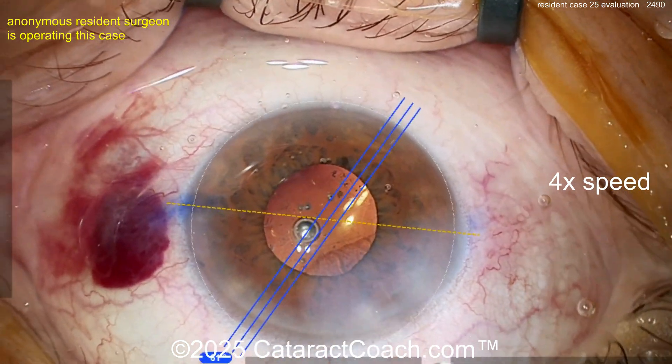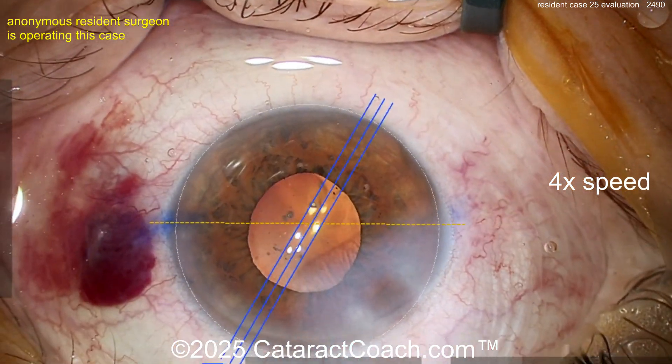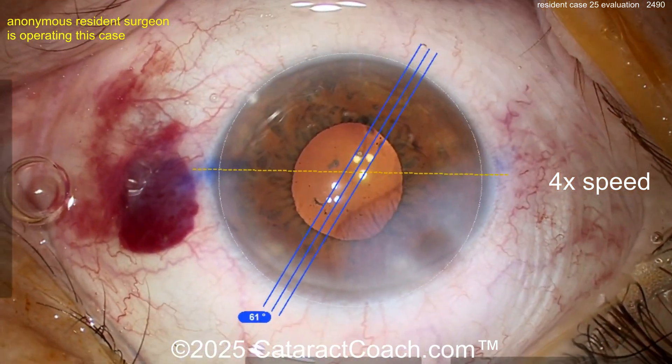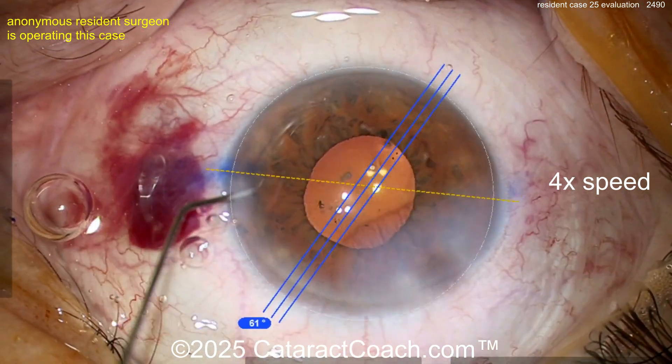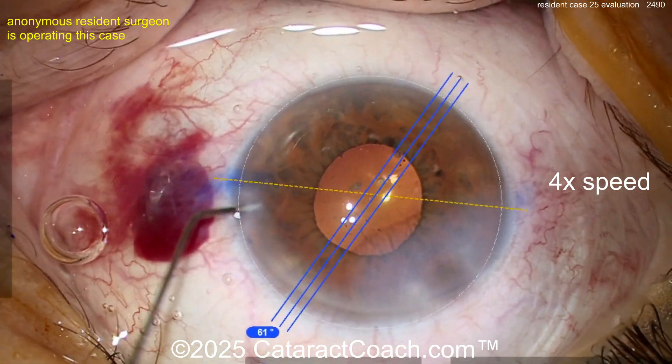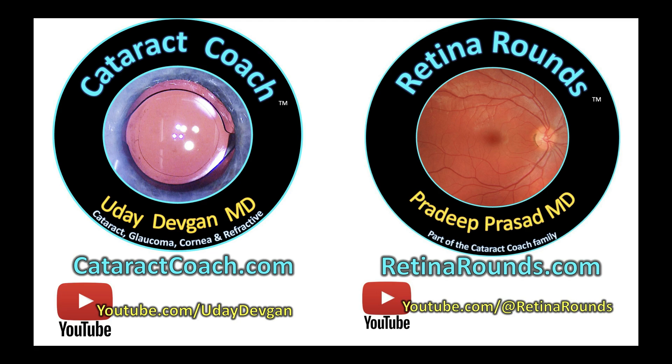Please slow it down, be more meticulous. Ask yourself what you could do better at every step of the procedure. This patient will have good vision in a week or two, but what's with that corneal hydration? I think you're great, you're fantastic — but put in the basic efforts to go back and do the easy steps right.